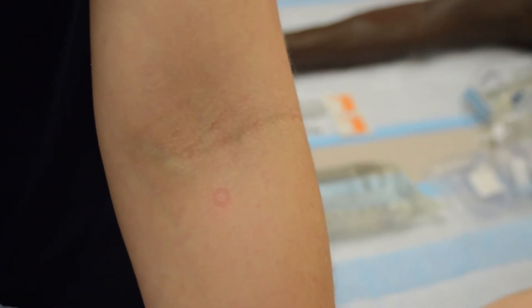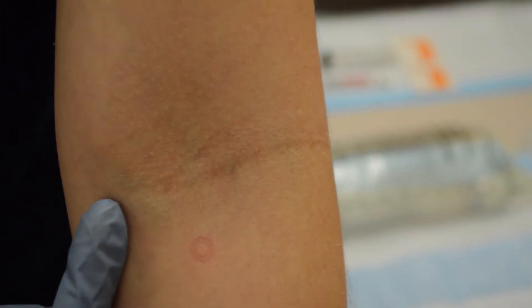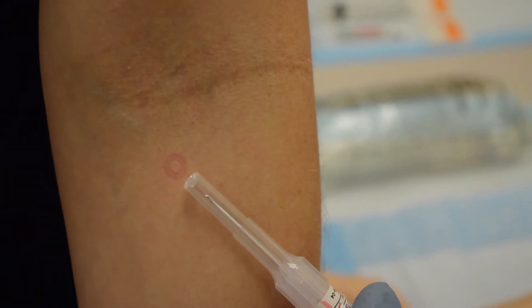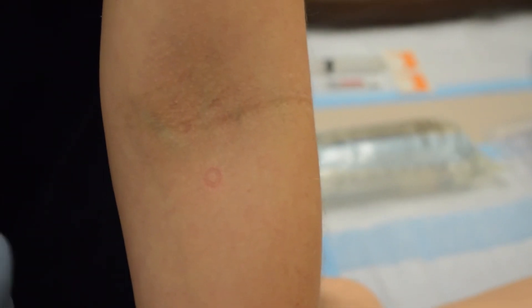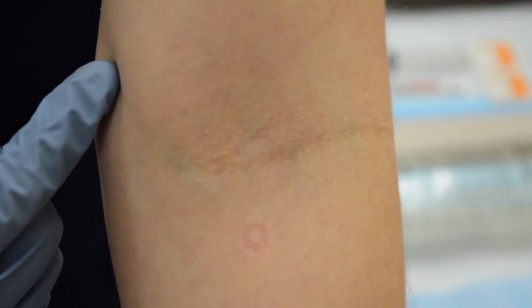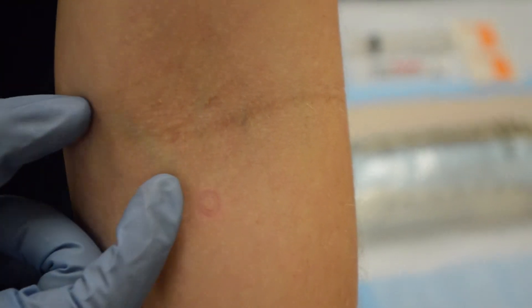Direction of vein is also very important. Not everyone's veins run up and down like the center vein does — sometimes they run at an angle. At that time, you want to make sure you are appropriately aiming your catheter, whether at an angle or straight forward. We also want to make sure we have enough of that vein available for the catheter to sit in. Always feel where your vein starts and follow it up to where it ends. Start your IV at the point where the vein starts so you have enough room for your catheter — that makes the IV more effective and less likely to slip out.